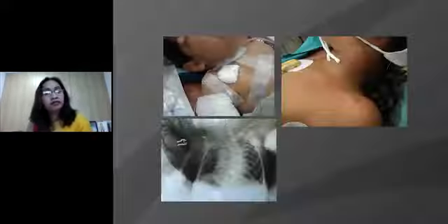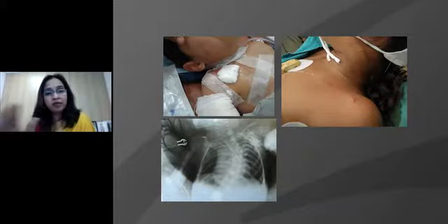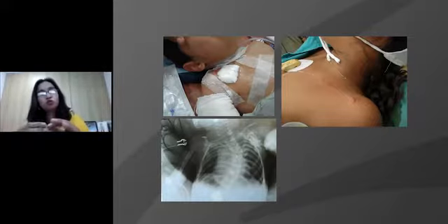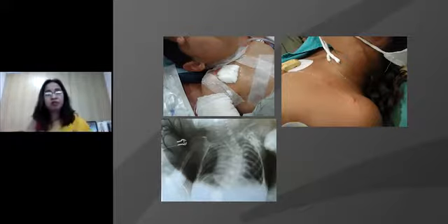We can put in a catheter again. The moment we create an anechogenic background, put in a Tuohy needle, put in a catheter just 2 to 3 centimeters beyond the Tuohy needle, tunnel it, fix it, and put it to an infusion pump.